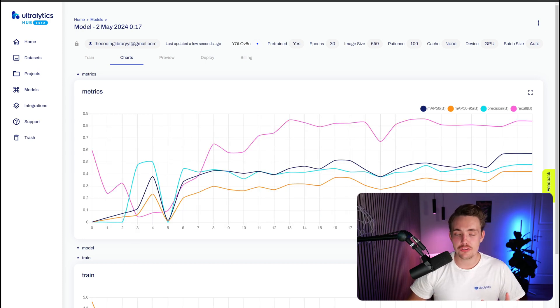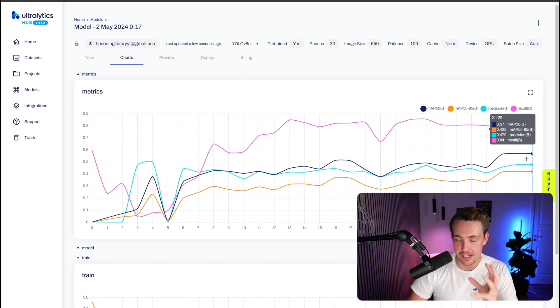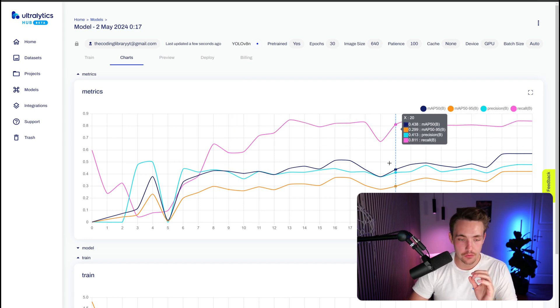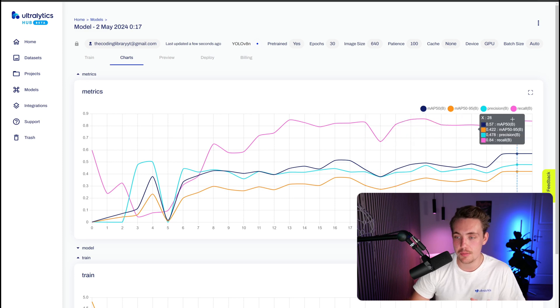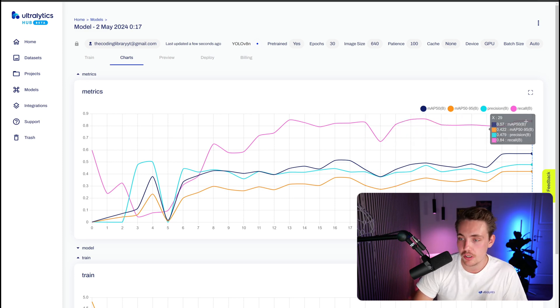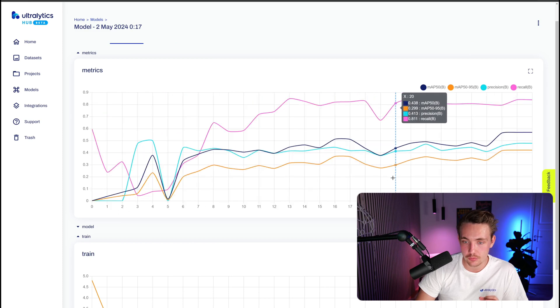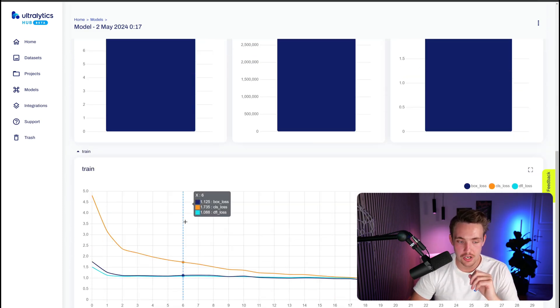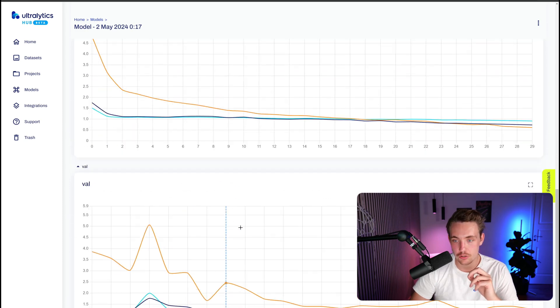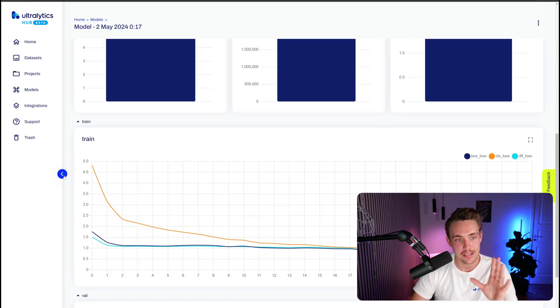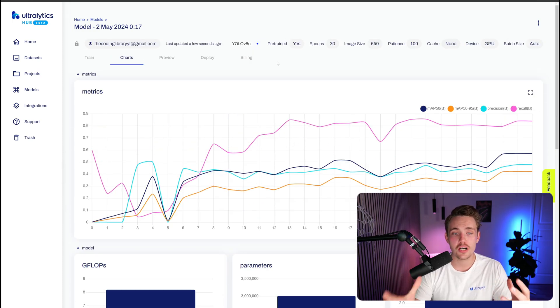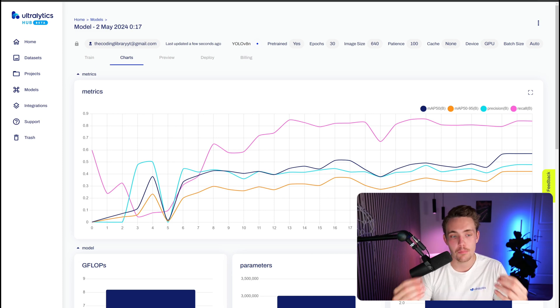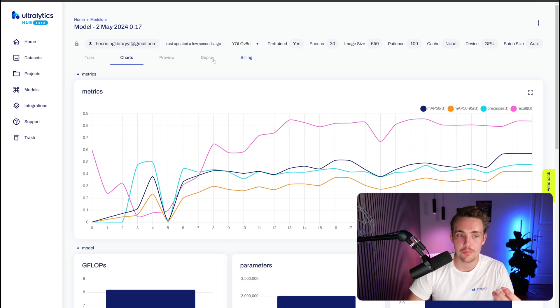Our model is now done training for 30 epochs. We probably could have been trained for 10, 20 epochs more, but we can see pretty nice convergence. Mean average precision is increasing over time, and also the precision recall. We have pretty good recall here, which is very good for this specific use case. We don't really want to miss any detections. We can also see the model training metrics and the validation. These are losses, which should be decreasing over time and also has converged here at the end. The model is now done training. We could also use a larger model. Right now we're just training on the YOLO V8 nano model. We could have used small, medium, and got better results. It's basically a trade-off between accuracy and speed.